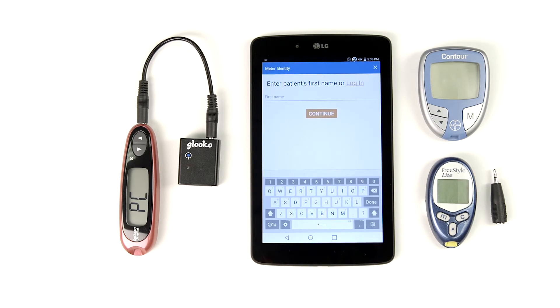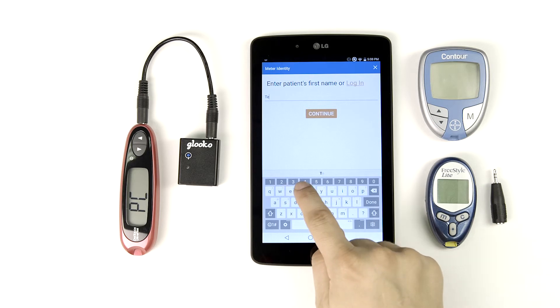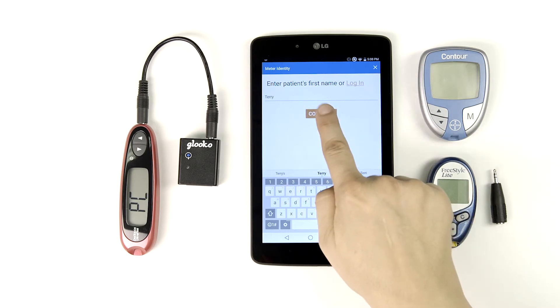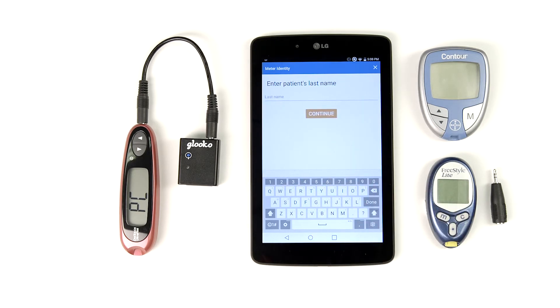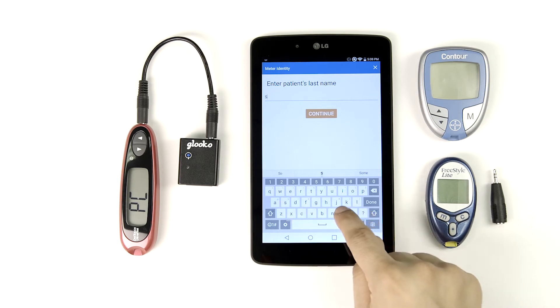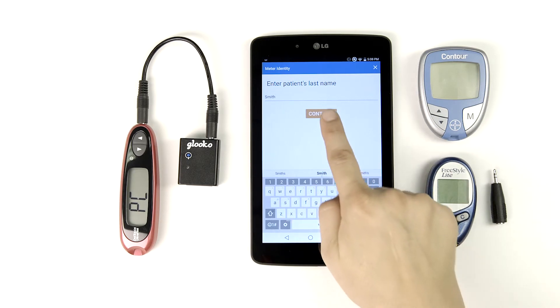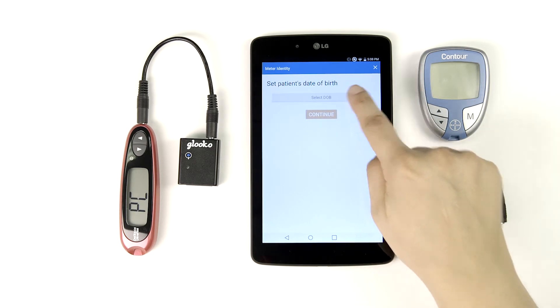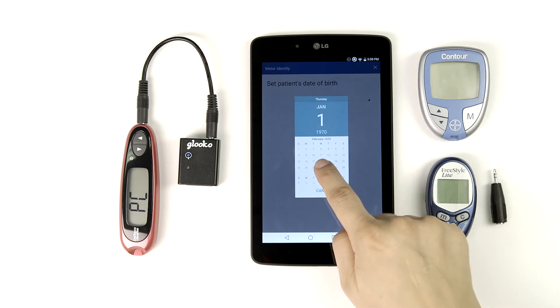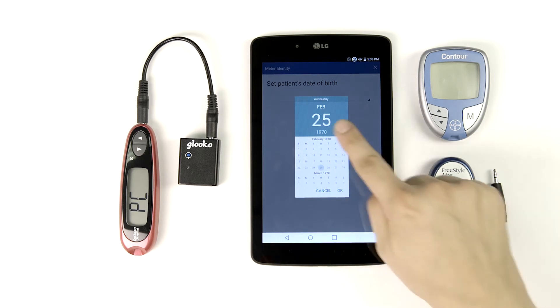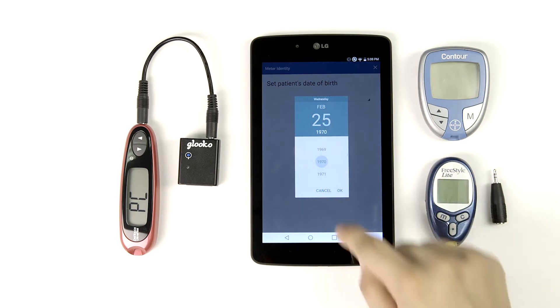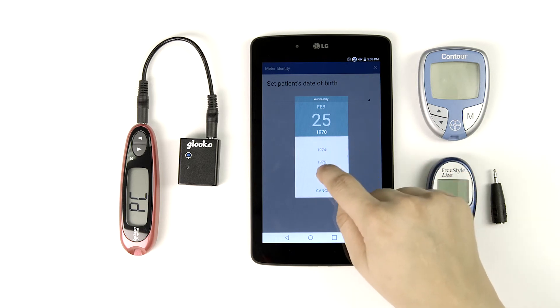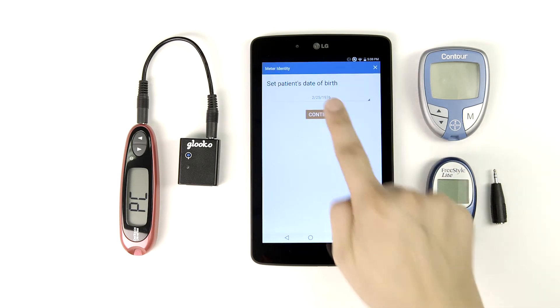Now we're ready to tell Gluco Kiosk who belongs to this device and its data. Type in your patient's first name and tap Continue. Enter the patient's last name. Tapping Continue will take you to the date of birth screen where you can select the patient's date of birth. If you need a different year, tap the year value once to receive a quick scroll option. Tap OK, followed by Continue.